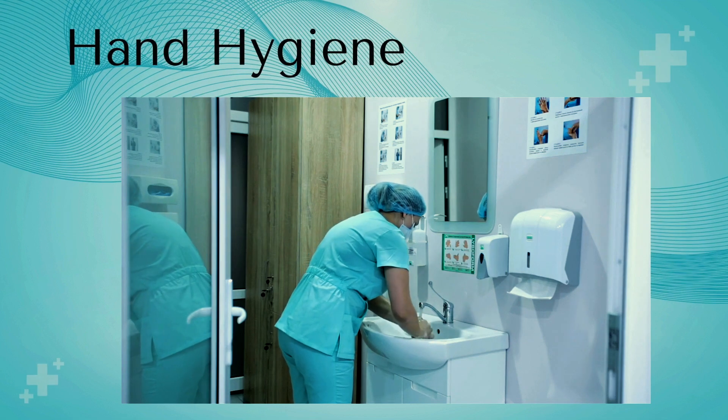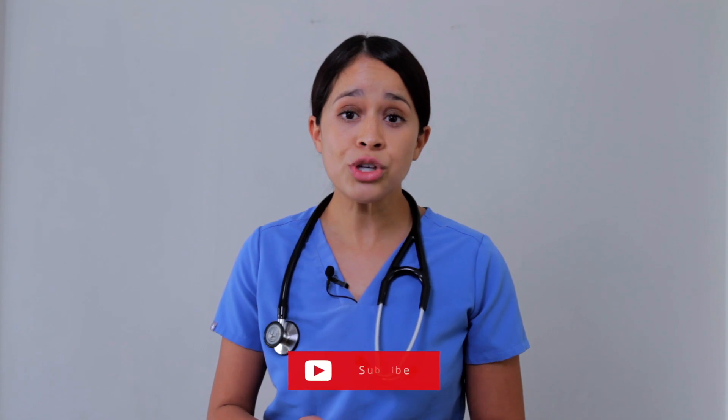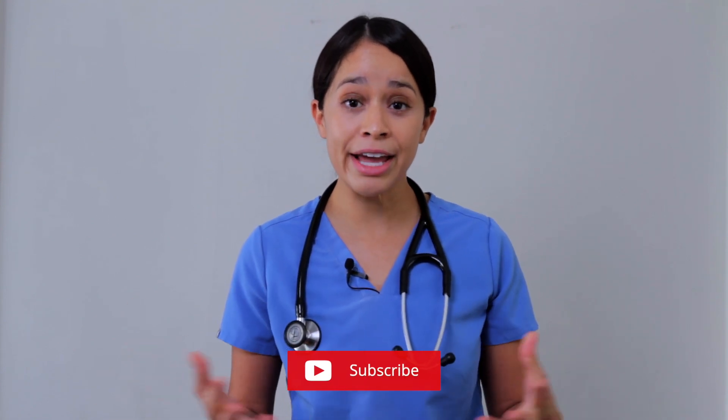Before we dive into the live sound demo, I want to go over a few important techniques that I find are crucial. First, hand hygiene — soap and water, and clean your stethoscope with an alcohol prep. I usually clean in between patients and let it air dry. You also want to make sure that you have a clock in your room or clinic or hospital setting, so you can count down the seconds, because we'll be counting for one full minute.